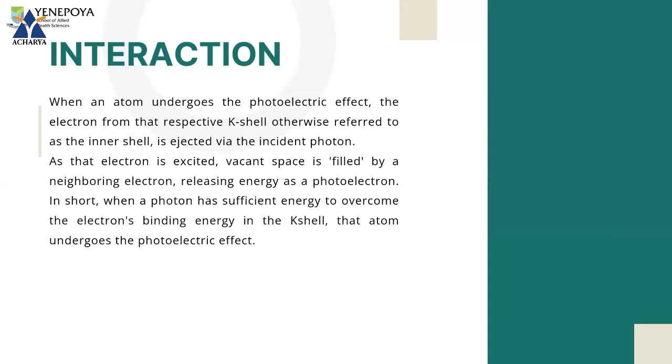As the electron is ejected, a vacant space is created, which is occupied by a neighboring electron from the L shell, because of which there is a release of energy. In short, the incoming photon should have sufficient energy to overcome the electron's binding energy in the K shell so that the electron can be ejected.